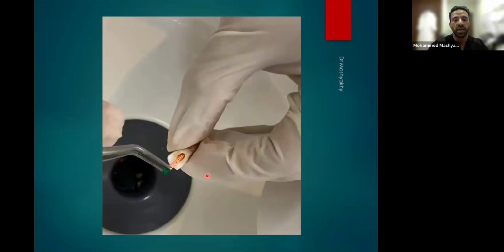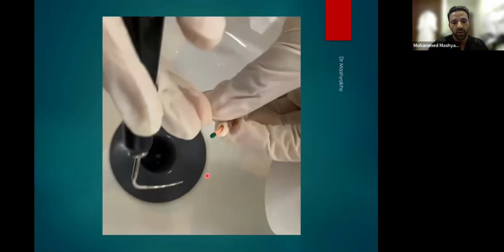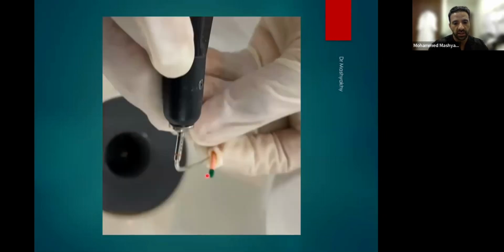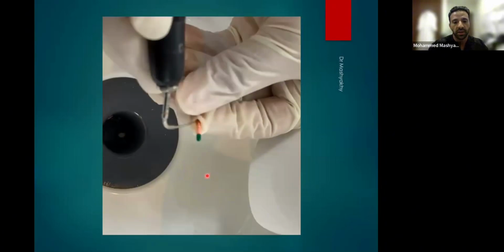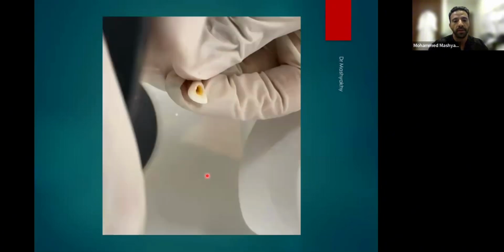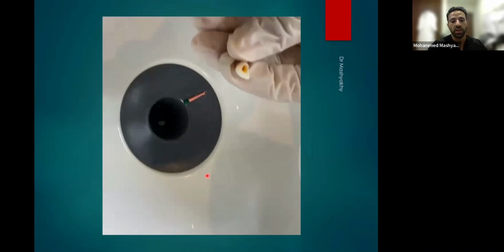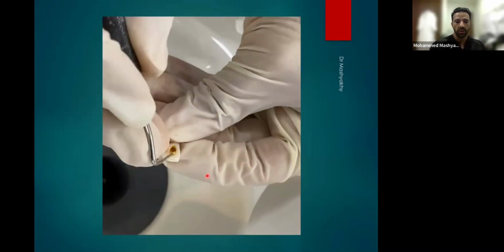Using this single matching cone, it's the heat cutter. You see how it looks and how fast and easy it cuts. Sometimes I need to go a little bit deeper. After condensation, I go again and cut 1-2 millimeters extra and do condensation. No problem with that at all.